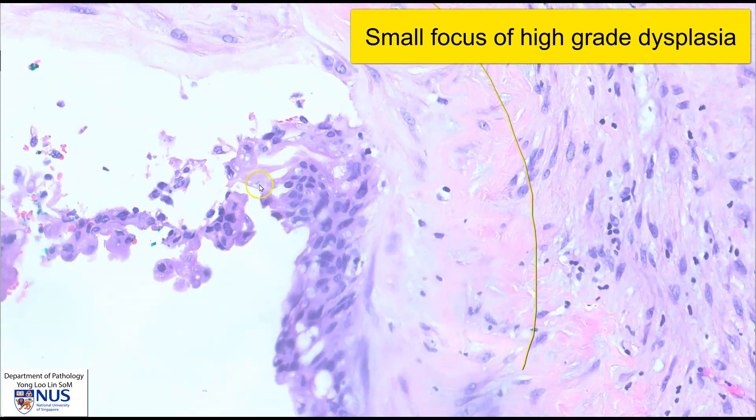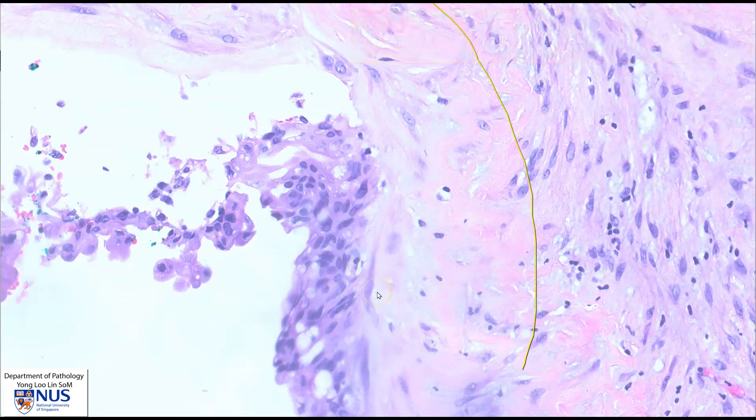This is a very small focus of high-grade dysplasia in this mucinous cystic neoplasm. So there can be a range of dysplasia from low to high. And in a small percentage of cases, there may also be invasive adenocarcinoma arising in mucinous cystic neoplasms. Let's learn a bit more about mucinous cystic neoplasms.